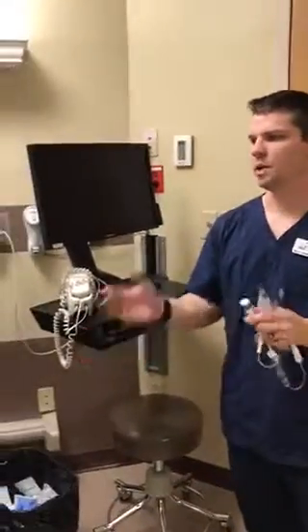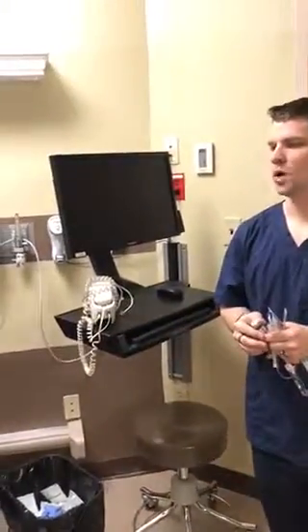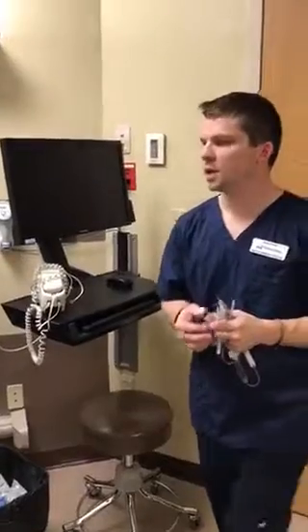So we're going to go ahead and get that set up. That's an infusion. I'm going to go ahead and give you the reasons that you're getting that, and why that's going in an infusion. And I would also give you any concerns why as you would be receiving that.